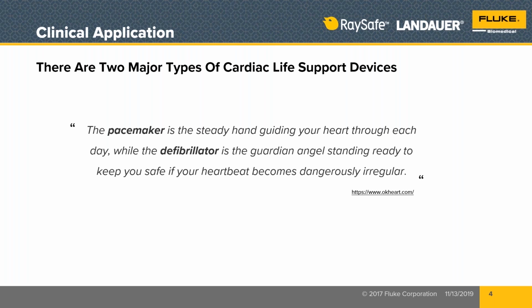All temporary pacemakers are designed to detect the lack of a heartbeat. And typically you don't pace asystole, which is a flat line, meaning no heart rate. What you pace is slow heart rates. So there is a heart rate there.